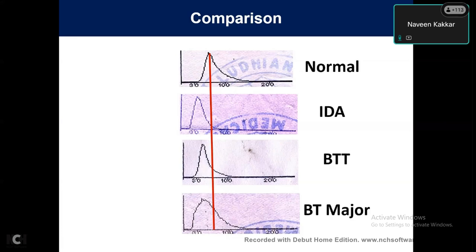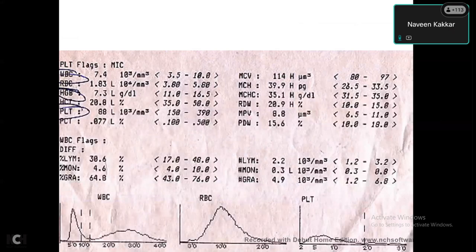So that's their comparison. So going on to macrocytosis now. You have anemia, yes, 7.3. MCV is high. RDW is high. So again, expect poikilocytosis. With a 7 hemoglobin, your RBC count is pretty low, which you would expect if you have ineffective erythropoiesis. So 1.83 with 7.3 is very, very low. So you would probably think this is megaloblastic anemia looking at the RDW and the degree of anemia.